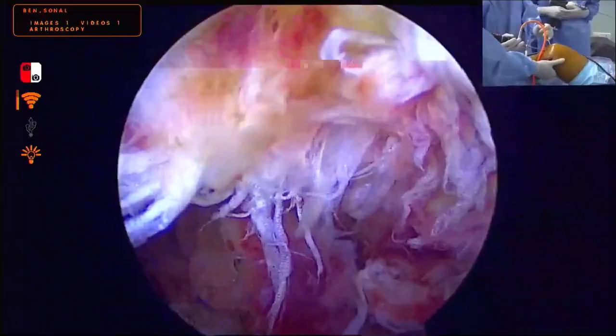Relax. Relax. So the first suture was grabbing the posterior medial bundle. Now this suture will be able to grab the anterior lateral bundle. Okay. Hold this one. Yes, as much as possible. So we are trying to put a deep bite into the PCL here.